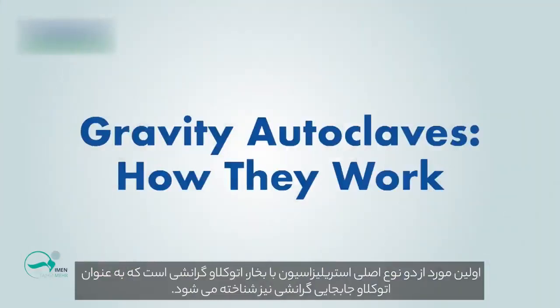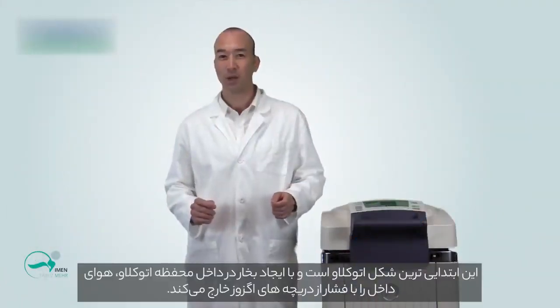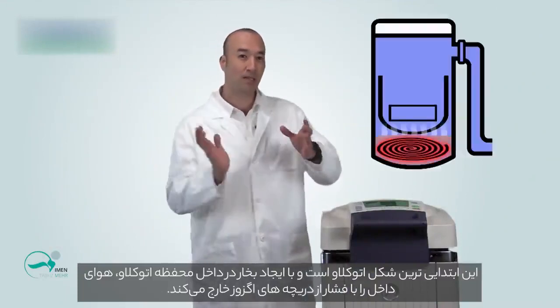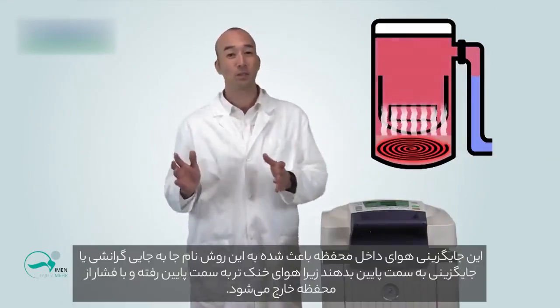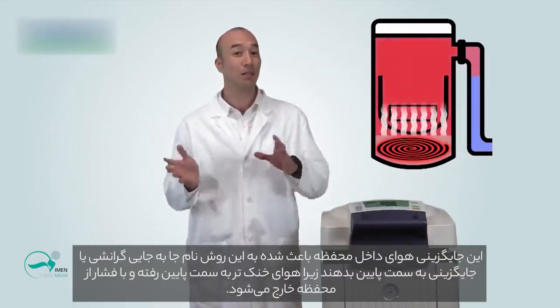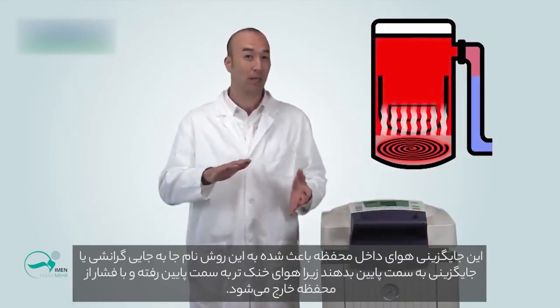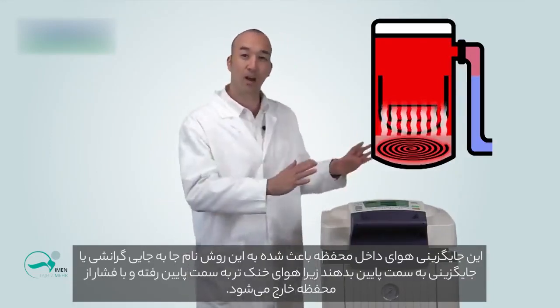The first of the main two types of steam sterilization is gravity autoclaving, also known as gravity displacement autoclaving. This is the most basic form of autoclave and involves creating steam inside the autoclave chamber, which displaces ambient air and forces it out of the exhaust valves. This replacement of the air in the chamber gives it the name gravity displacement and is also sometimes referred to as downward replacement because the relatively cooler ambient air travels downward and is forced out of the autoclave.